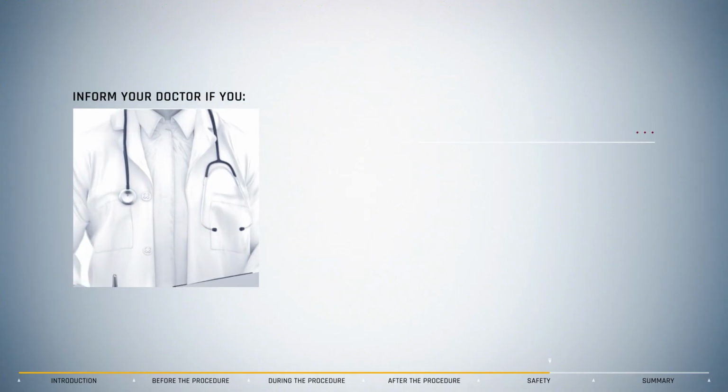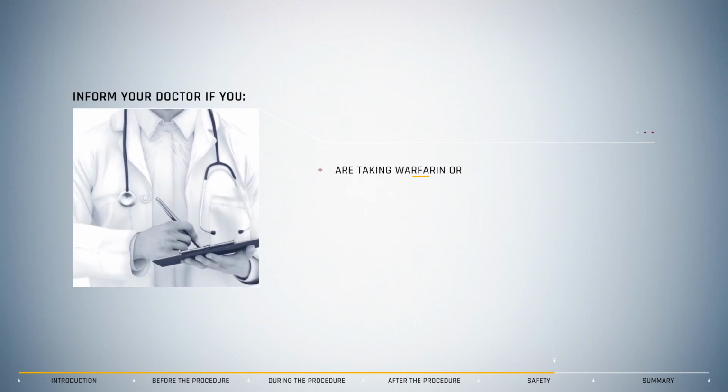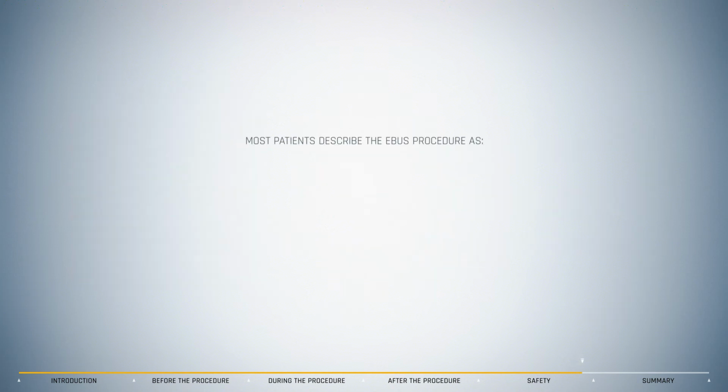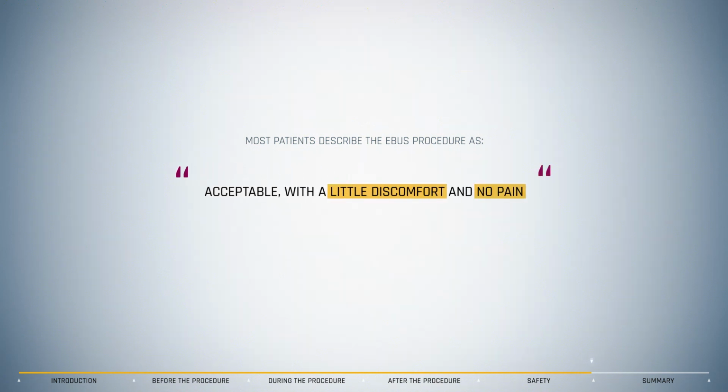Please inform your doctor or nurse if you are taking warfarin or clopidogrel, if you have had a heart attack or stroke in the last 6 weeks, if you have had an infection of the heart valves in the past or have had your spleen removed. Most patients that have undergone EBUS would describe the procedure as acceptable with a little discomfort and no pain.